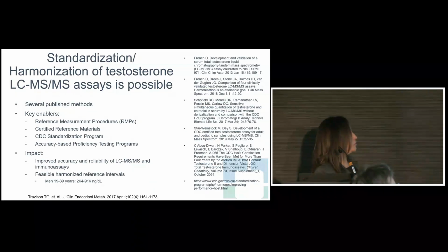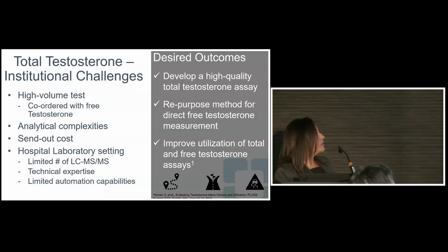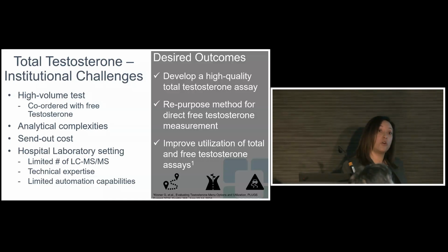So that's great news. So with that in mind, we thought we could undertake the task of developing a total testosterone assay using all the foundation that is out there in the literature. We do have certain challenges that were our own. This is a very high volume test in our institution, and it's coordinated with free testosterone.